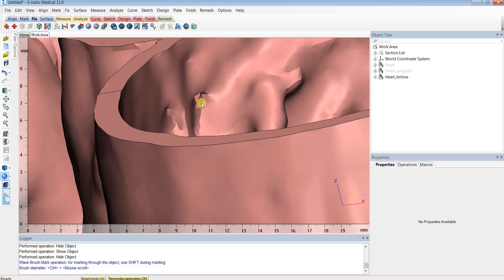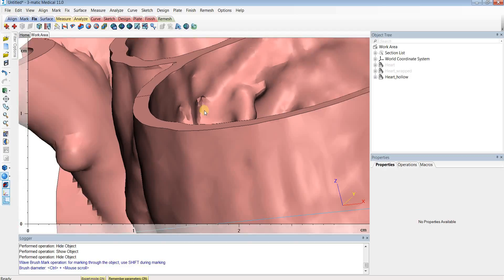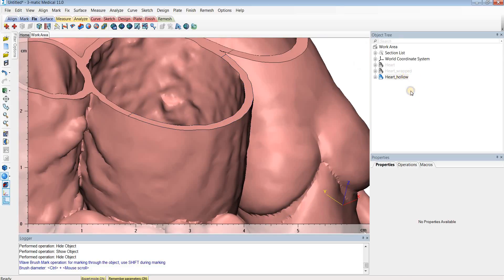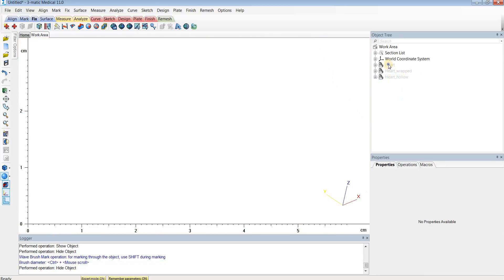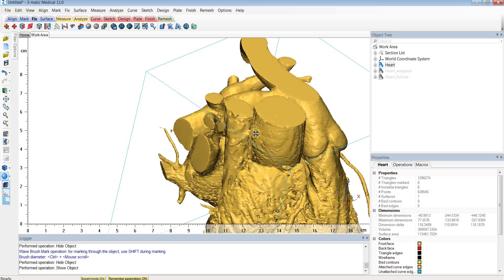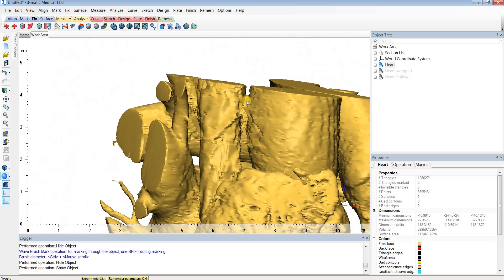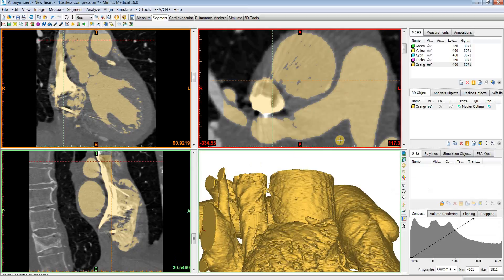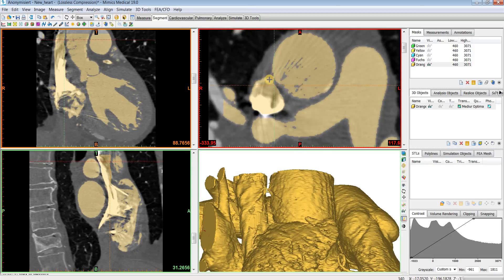The first cause is if you over-segment in that region. If we look at the original 3D model that was calculated, you'll see there's a connection between the SVC and the aorta. And if we look at our segmentation, you'll see this connection at the mask level as well.